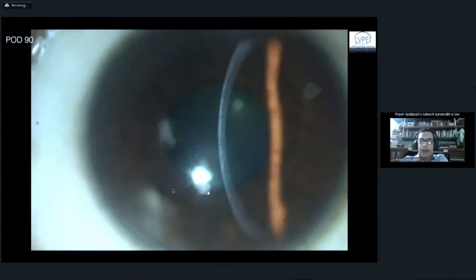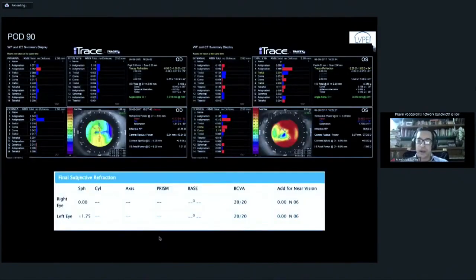the patient got better. But sometimes, if this fluid is present in the stroma or in the interface for a long time, it can lead to interface scarring, and this can lead to a hyperopic shift in the refractive error long term, after the fluid has resolved as well.